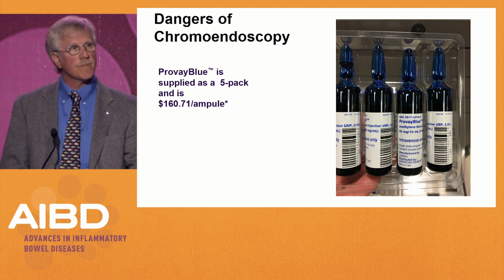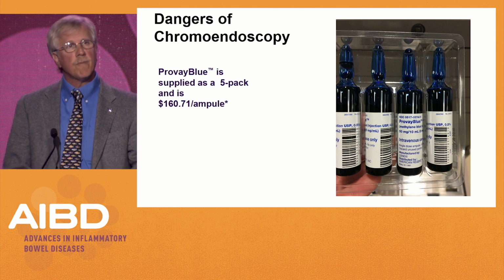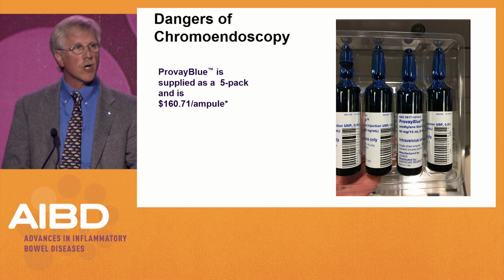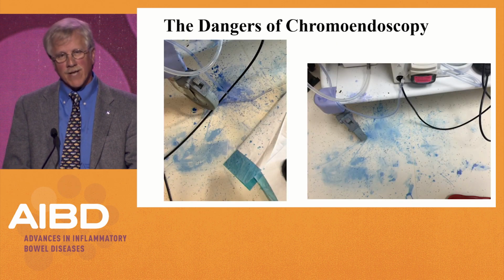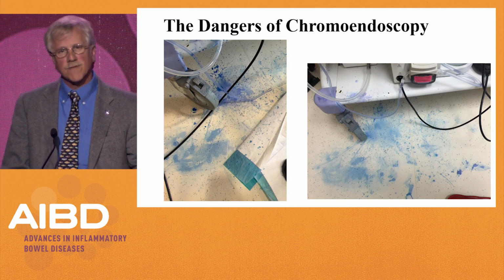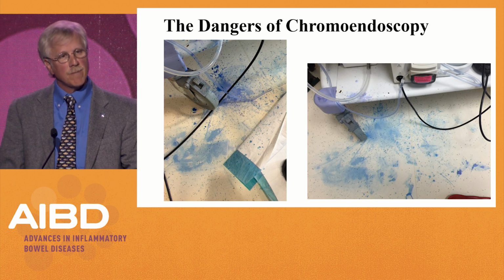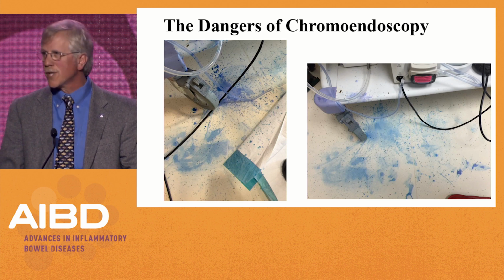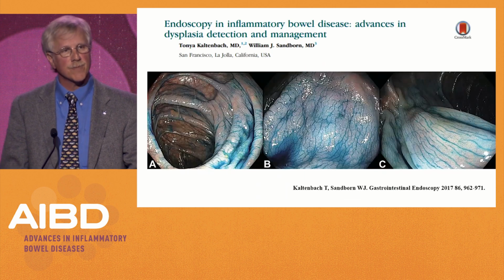And if you're in an outpatient endoscopy suite, this may be cost prohibitive. One of the biggest dangers of chromoendoscopy: don't wear your best shoes when you go and do your chromoendoscopy. This is our endoscopy unit after a particularly difficult day where we spilled our dye. It can come out, but folks have to come and completely re-wax the floor. So it does create a lot of issues for me if we have a bad day in the endoscopy suite.